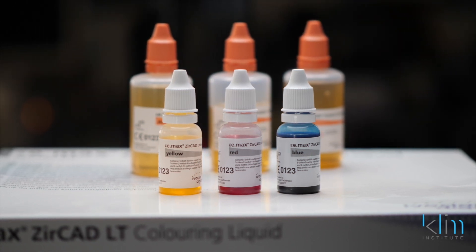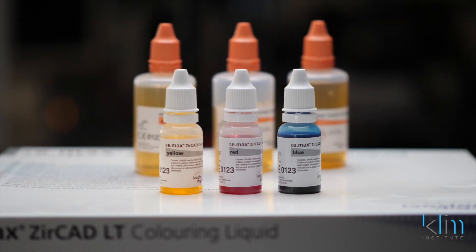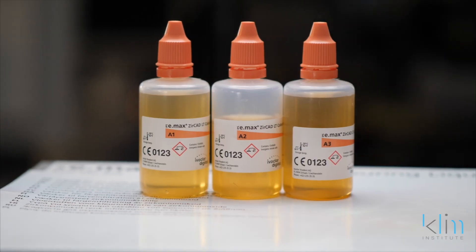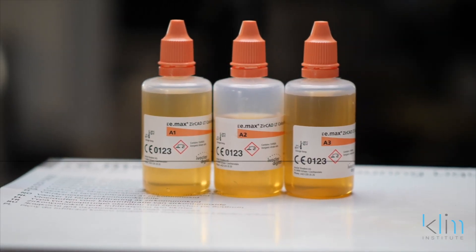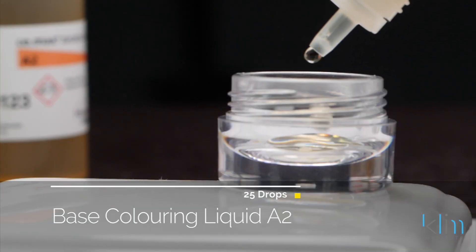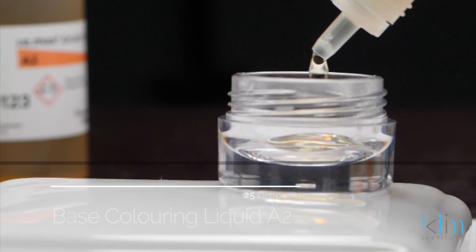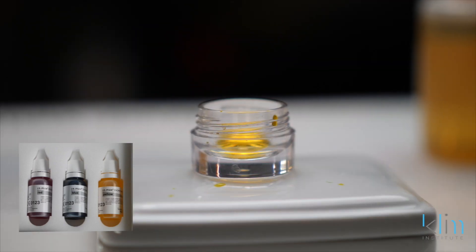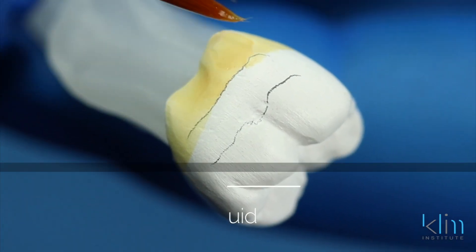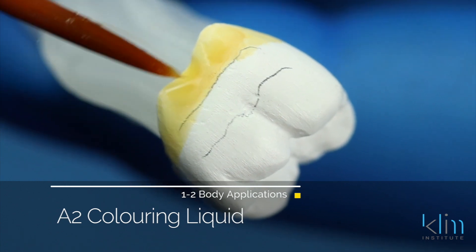The coloring indicating liquids come in three colors: yellow, red, and blue. We can use a combination of those, therefore we have no limitations — those cover the full color spectrum for us. To get started, my base color is going to be A2; most of the time I'm going to use A2. What I'll do with A2 is put 25 drops in a jar — these are the mixing jars in the kit — and then I'll put two to three drops of the yellow dye. With this system, I know that the yellow color is always in my cervical and body one-half.